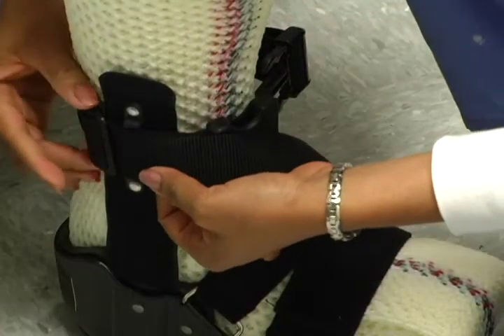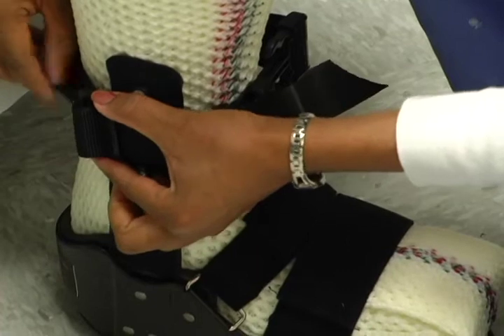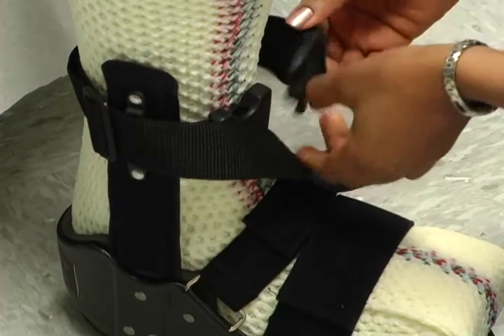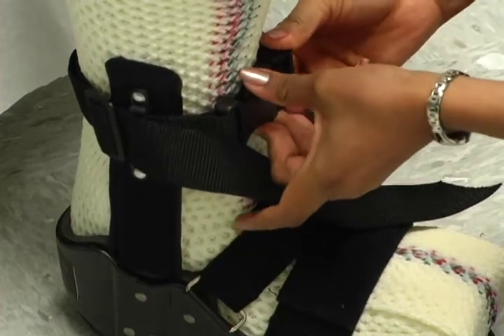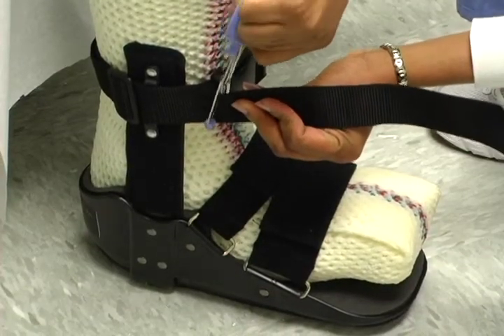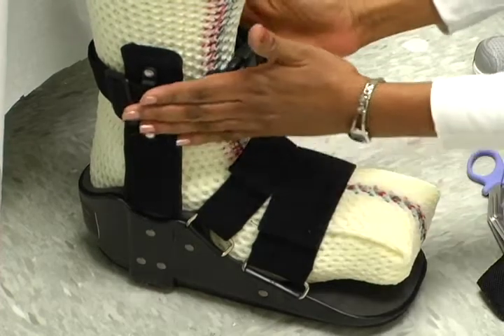Adjust the top strap so it is snug around the leg of the patient to keep the walker boot positioned properly relative to the patient's leg during ambulation. Ensure the loose end of the top strap is still secured by the plastic strap holder in the back. To shorten the top strap, cut it just longer than the desired length to allow a small amount of fray and not leave a sharp edge. Allow the patient to weight bear.